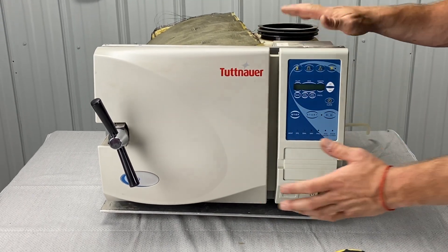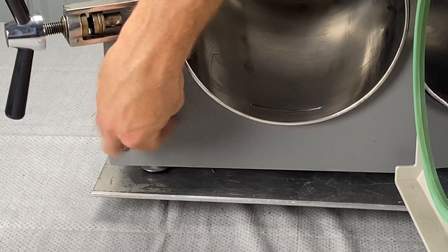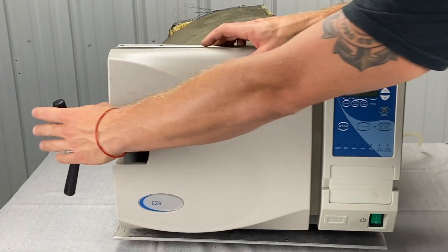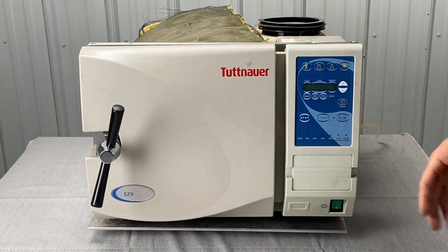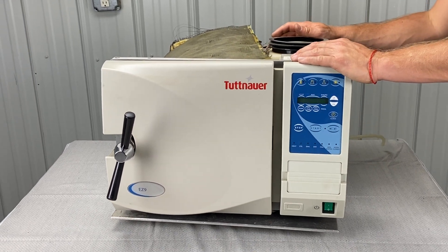Make sure the unit is unplugged and there's no water inside. To drain the water, there's a screw that you unscrew and water flows out. Put a bucket underneath it, put a tube on it, and drain all the water out. That way, if you drop any tools inside the reservoir, they're not dropping into whatever's in there.